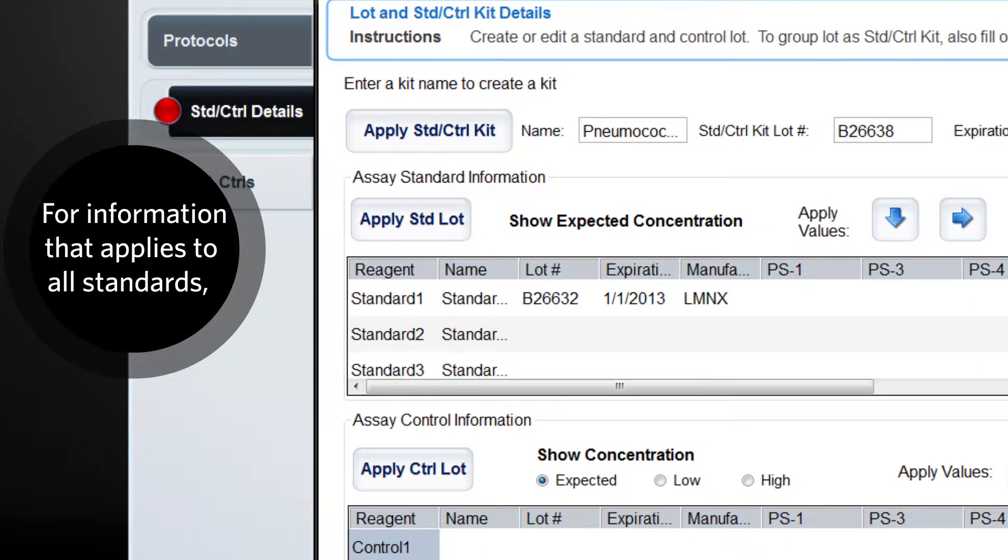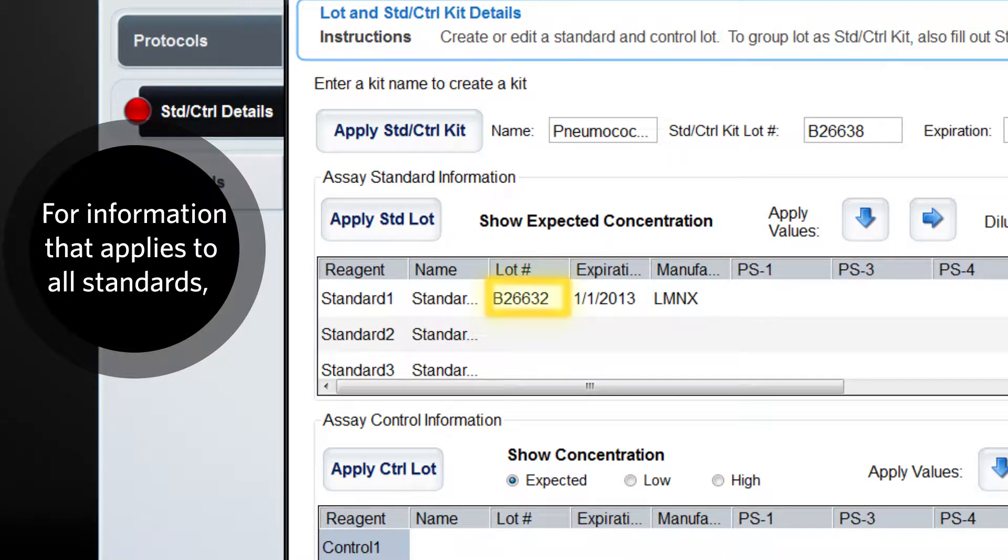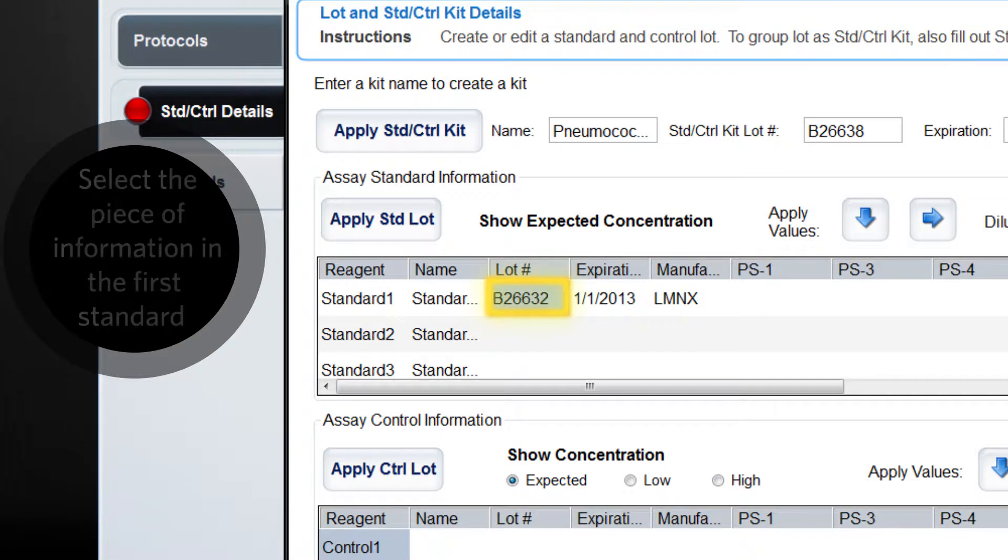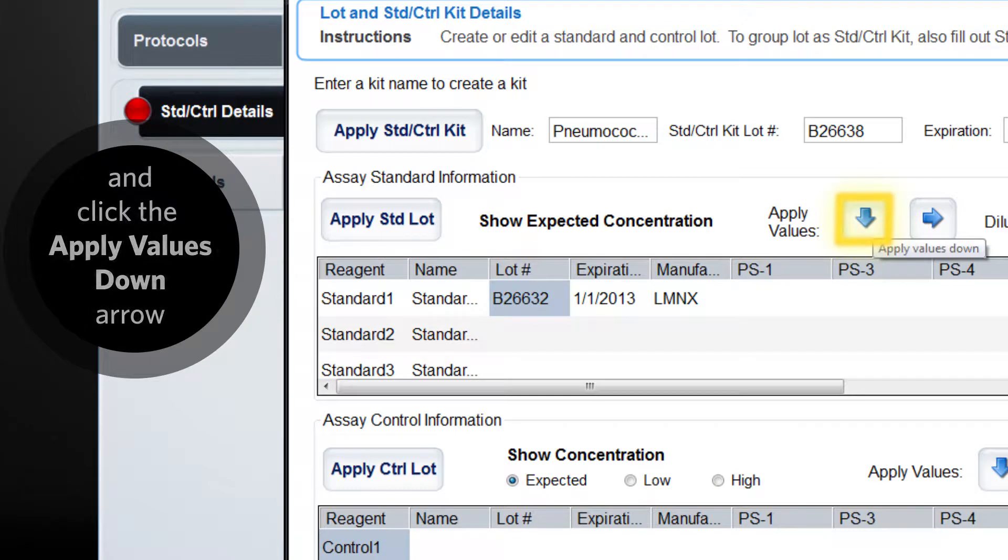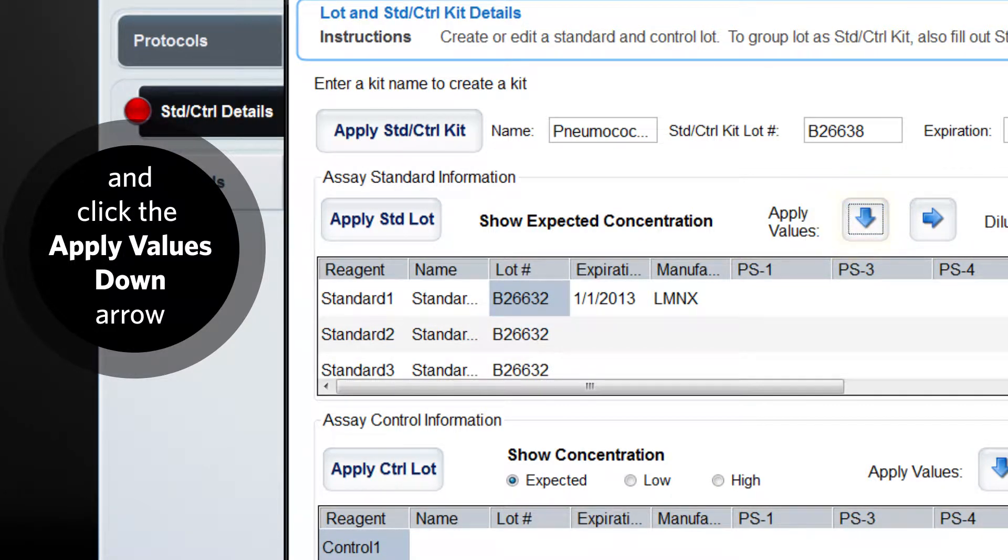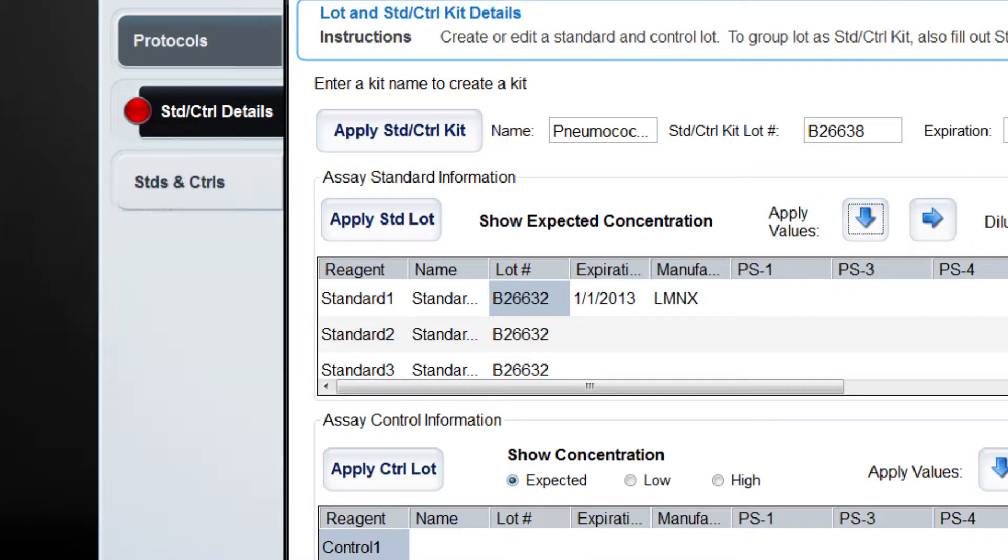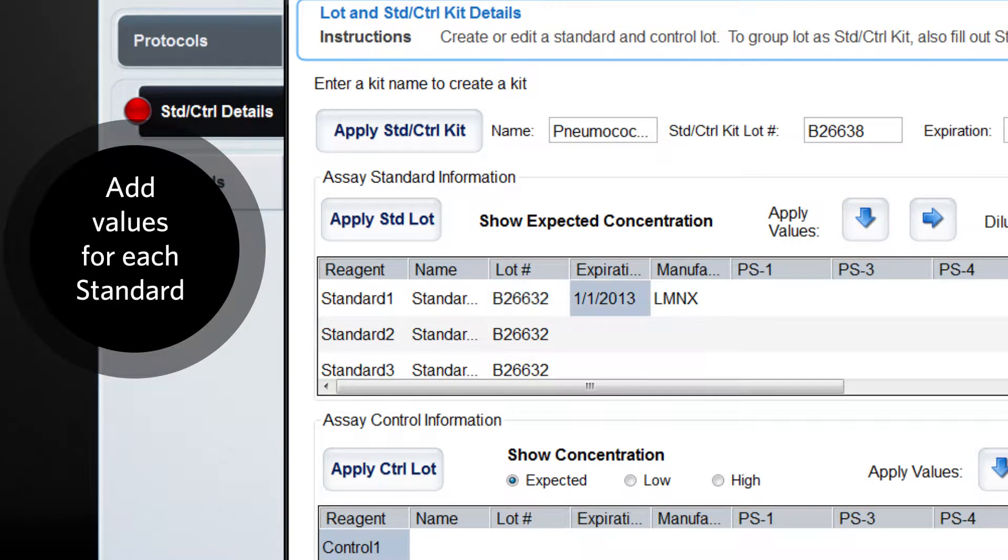If the information you entered applies to all standards, select the piece of information in the first standard and click the apply values down arrow. Then, go back and add the values for each standard.